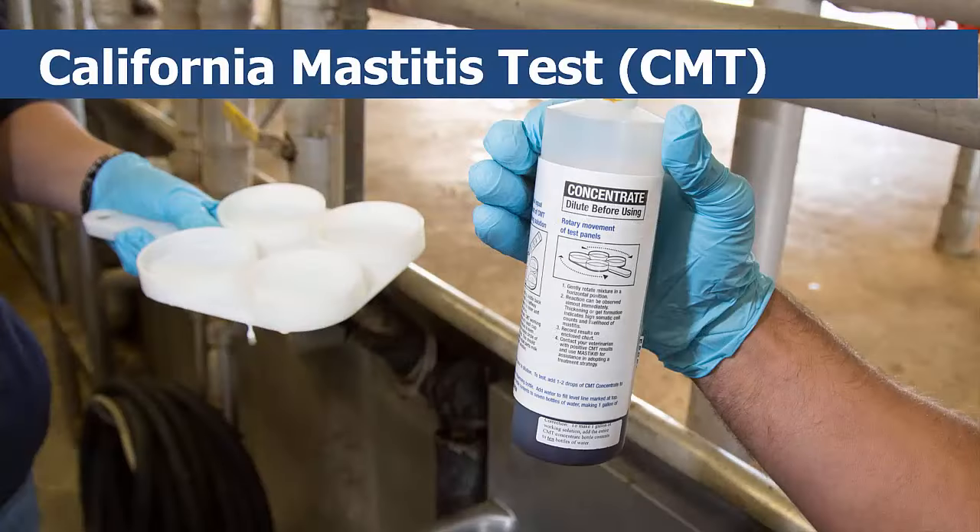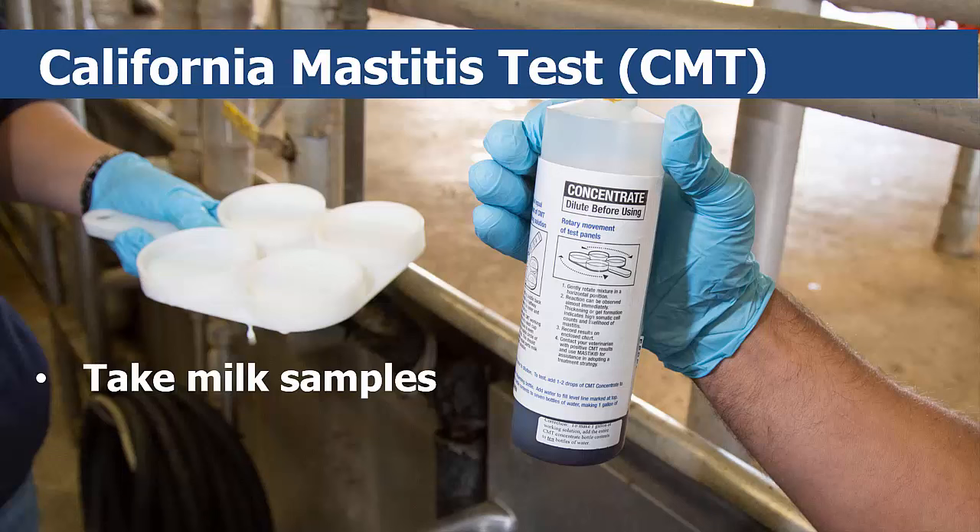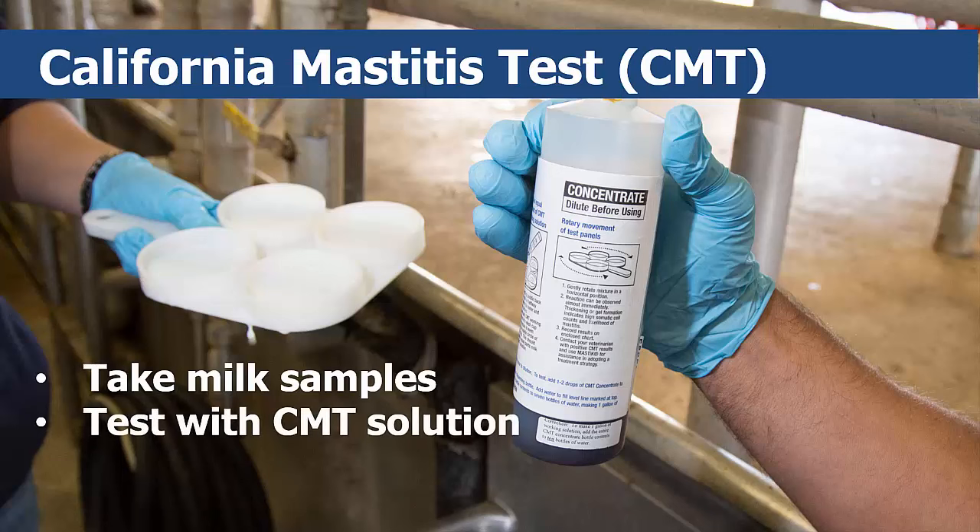This video will introduce you to how to properly perform and analyze a California Mastitis Test, or CMT. CMT involves taking a milk sample from each quarter of a cow, mixing those samples with CMT solution, and then visually reading the results to detect if an infection is present.